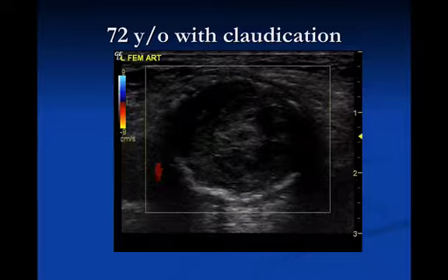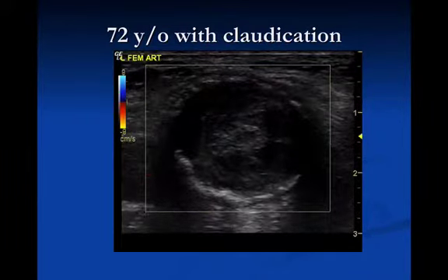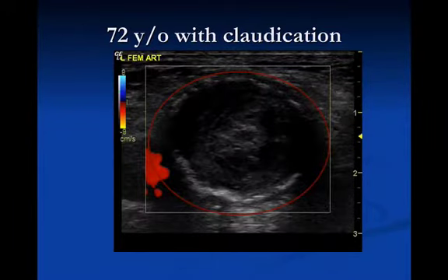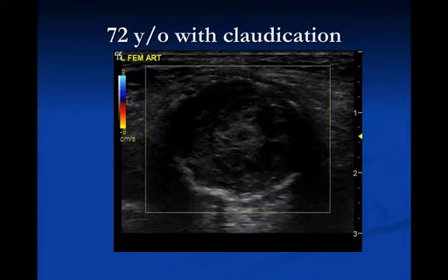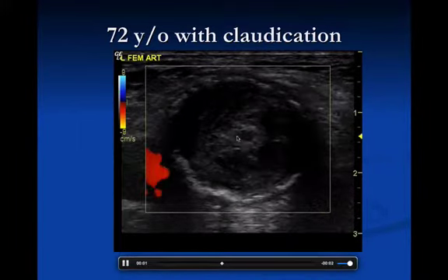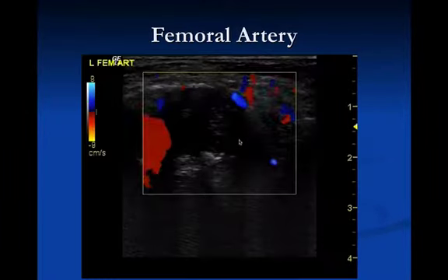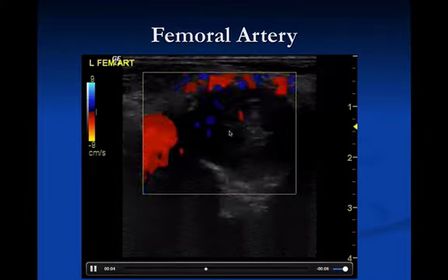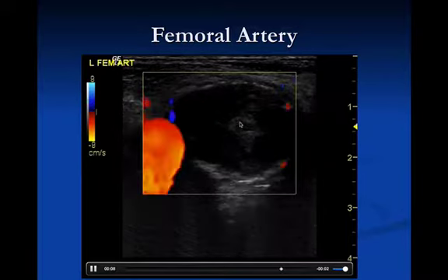And so I put the ultrasound on his leg first to see what kind of flow it had. And it indeed didn't look like it had a whole lot of flow here. And that femoral artery looked pretty generous in size. And you can see just a little middle area here that maybe could have flow, but I didn't see it here. I put it on here again to look for flow, and occasionally I would see like a little flicker of flow going through the middle.